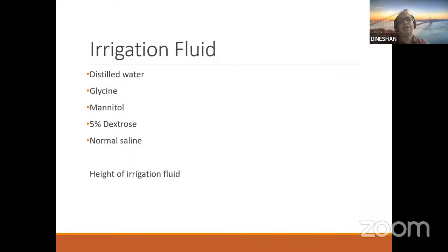And coming to a little bit of theory about the irrigation fluid used. The commonest irrigation fluid used is glycine 1.5%, and the other thing is distilled water. These two things are commonly used.